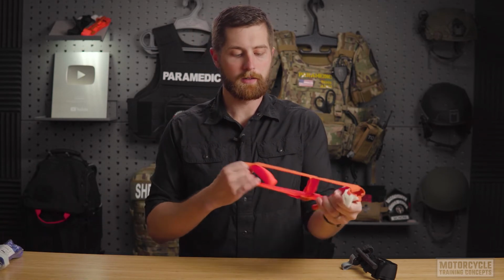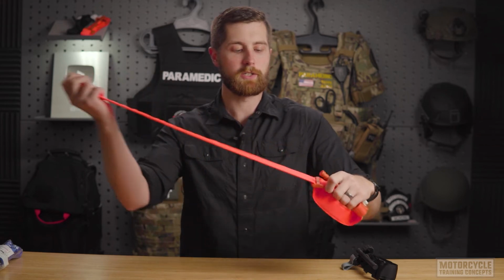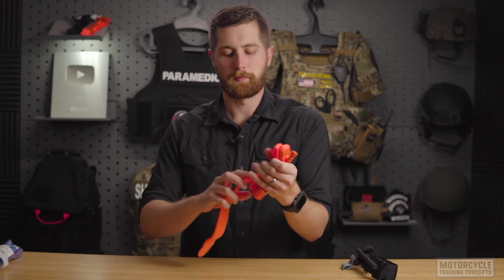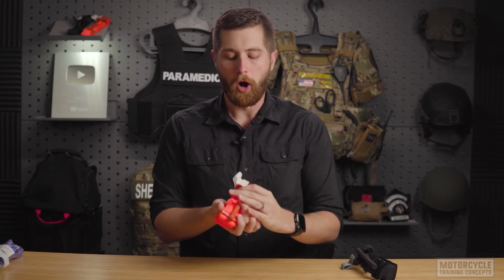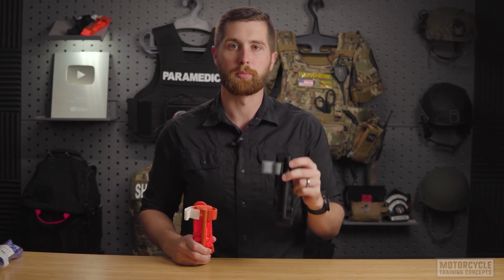Lastly, the other mistake I see people make is that they pull this tight when they're staging it. So they'll pull this all the way tight and then they'll just accordion this beyond it. Now, the downside to this is that when I go for self-application or to apply it to somebody else, I have a very small opening and it's very hard to put it over a limb. All of these will slow down your application, so make sure that you have this staged appropriately in your kit.